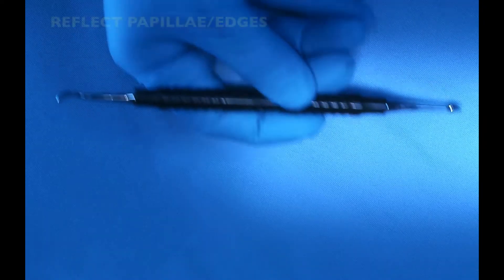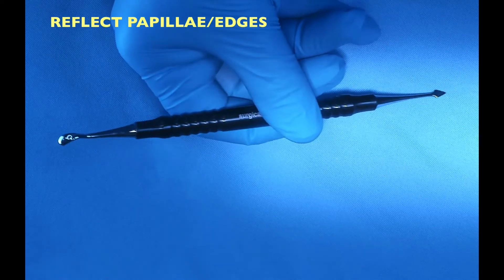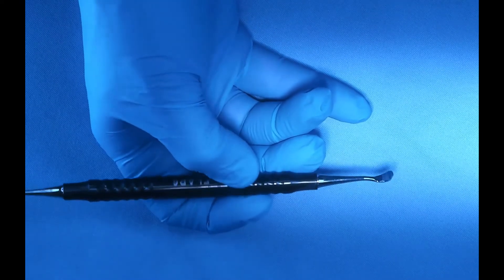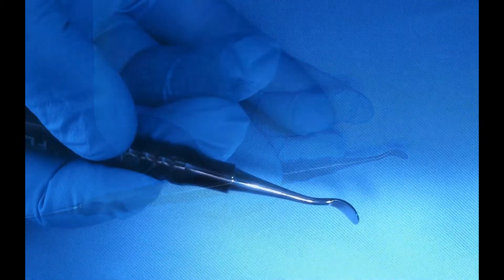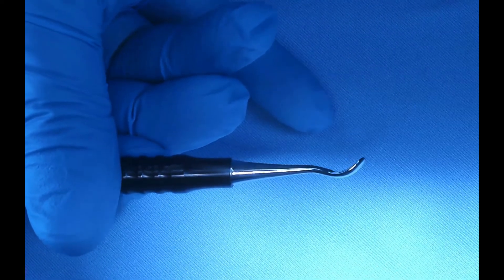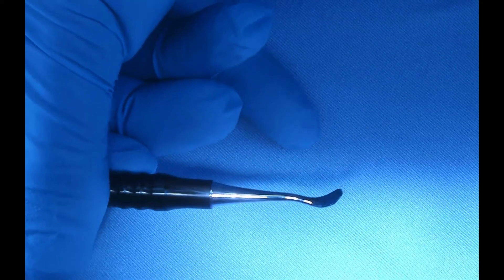The last flap instrument is called the Boozer elevator. This one I use for reflecting a papilla when I need to use extra caution not to damage friable tissue, or when I need to undermine a papilla and reflect it in partial or full thickness depending on the case. It has two sides — one side has a curved structure that looks almost like a little spoon, which allows me to undermine behind the line angle of a tooth, for example, which is where the papilla is.